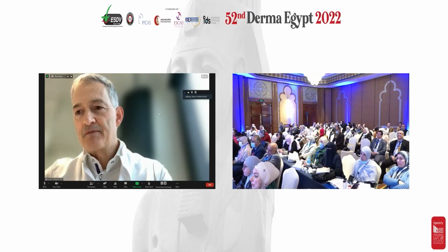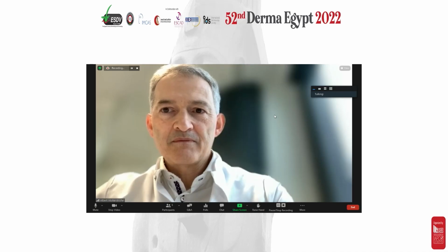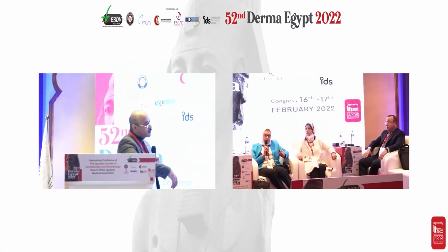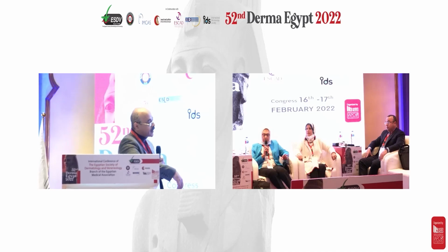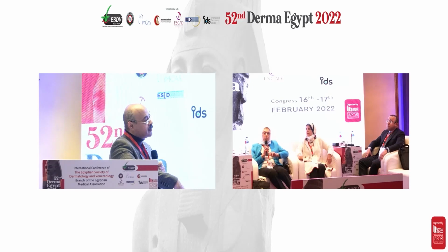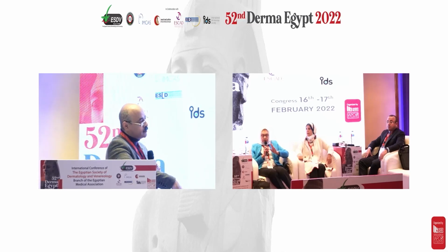Okay, thank you. I support that opinion, but let us hear the Egyptian experience. Yes, in our experience, the first pigmented lesion for which we use laser is nevus of Ota. It is the first choice and the only solution to the problem. For nevus of Ota it's very effective, with excellent results and no recurrence. For 20 years I have been using the Q-switched laser for nevus of Ota with no recurrence at all. We can use it for lentigines, senile and solar lentigines, but we inform the patient that there is recurrence in these conditions and we have to use sunscreens forever.